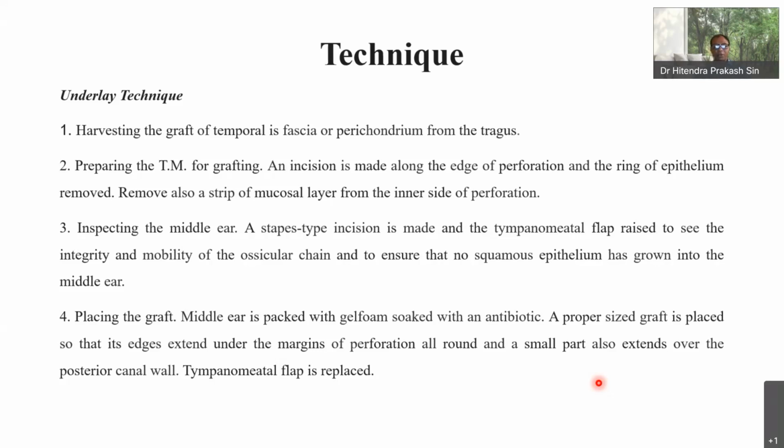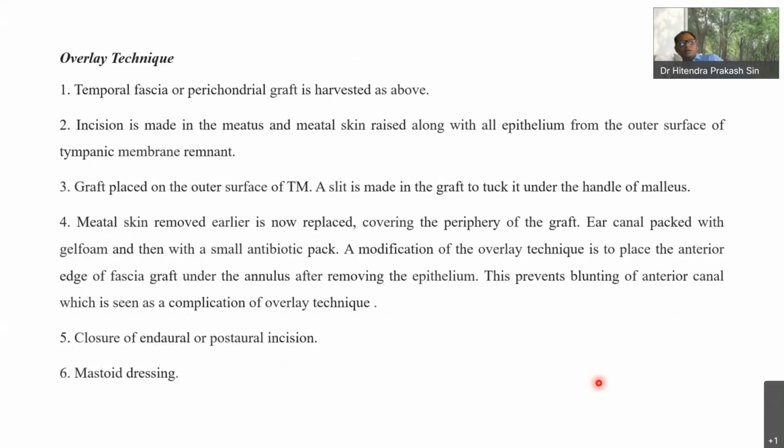Okay, we put the graft under the margins of perforation. This is the difference between overlay and underlay. Same thing is there. In the overlay technique, the graft is placed on the outer surface of the TM. In this technique, we do everything similar.